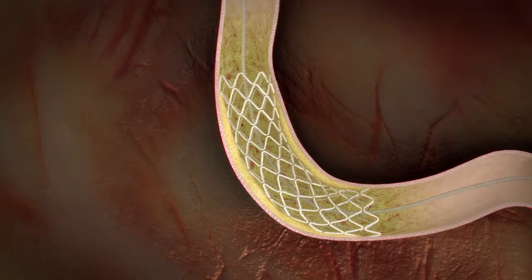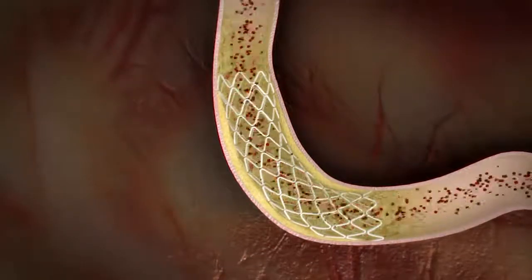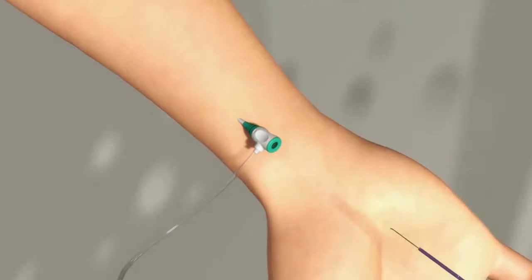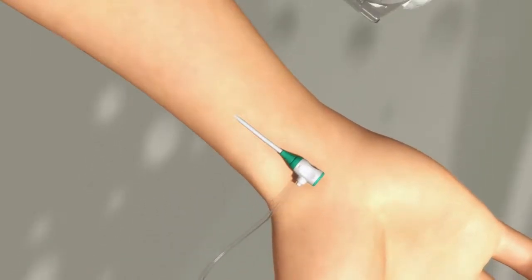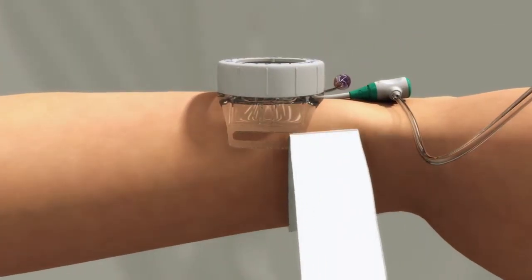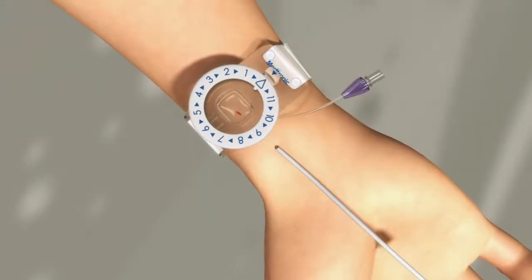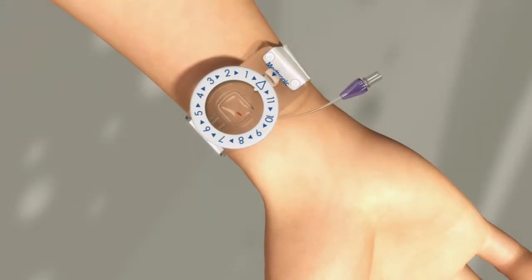When your doctor is satisfied with the placement of your stent, final X-ray images are taken to be sure that your blood flow looks favorable. Then your doctor gently removes all of the devices used during the PCI. The puncture site is sealed with a special device applied to your wrist or groin area, which stays in place until all bleeding has stopped.